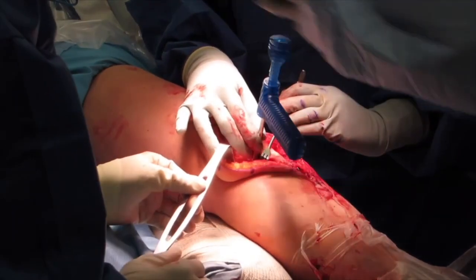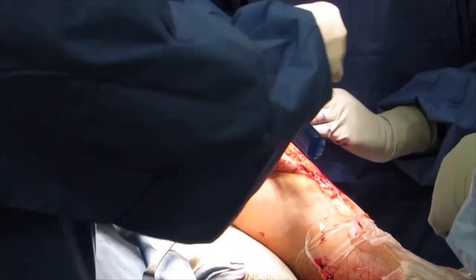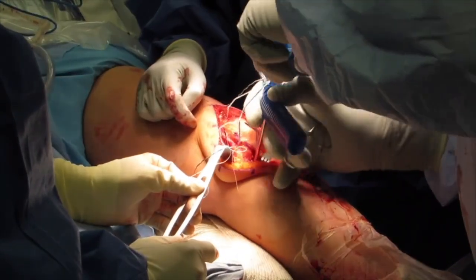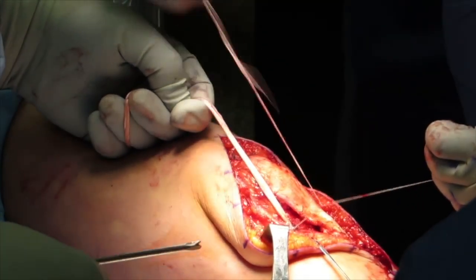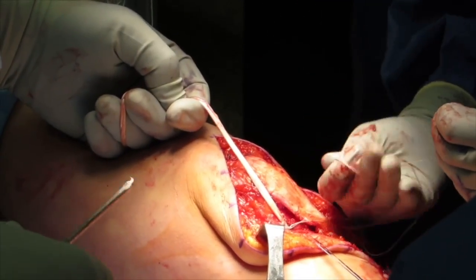Once confirmed, this area is debrided of soft tissue and decorticated with a burr or rongeur to a bleeding subchondral bone for graft healing. Dependent on patient size, a 1.8 or 2.6 millimeter Arthrex FiberTech knotless suture anchor is then placed into the proximal tibia. A hamstrings allograft greater than 15 centimeters in length and typically 4 to 6 millimeters in diameter is first placed through the tibial anchor loop and secured to the epiphysis.